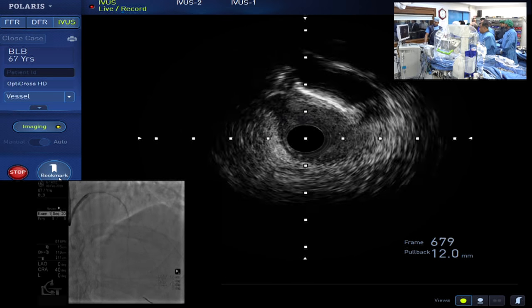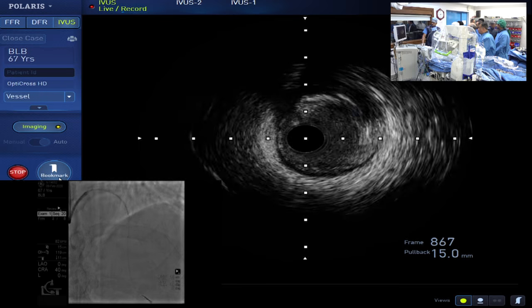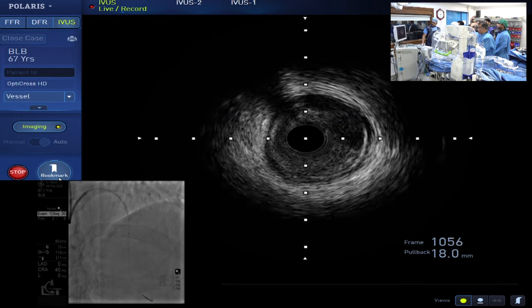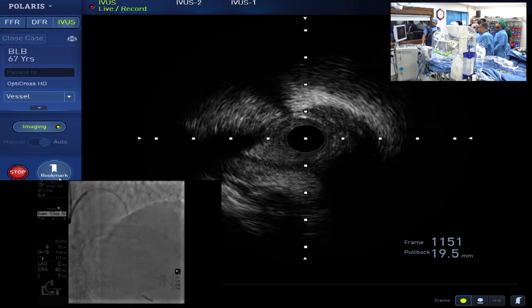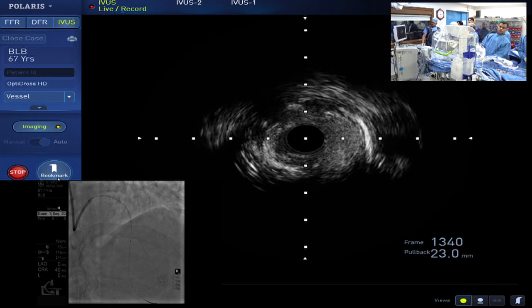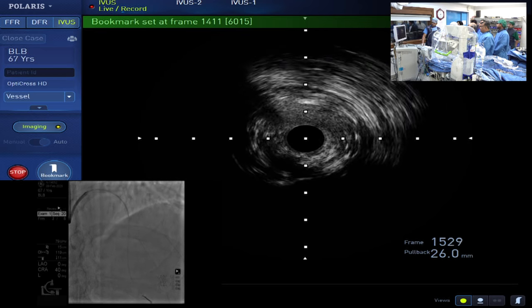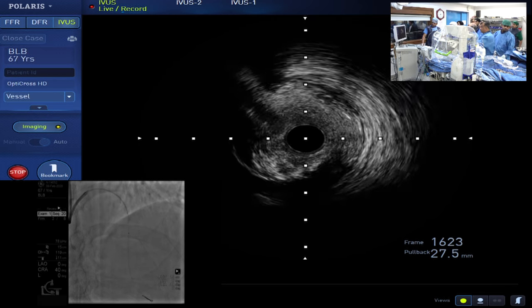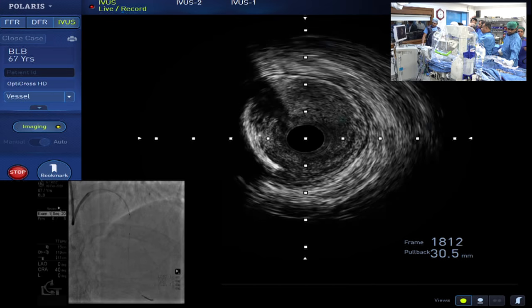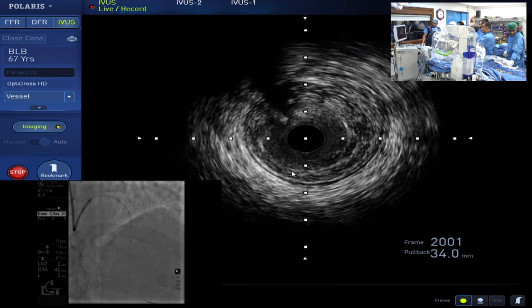Might be shrinkage of the vessel, right? So you have to take into account some shrinkage. There's some calcium here. Then here is a branch, might be septal perforator, yes, and here is a big plaque and spotty calcium with very fibrous tissue. Almost a huge vessel here, right? Might be some positive remodeling, but it's in the deep calcium, it might not be a big problem, right?